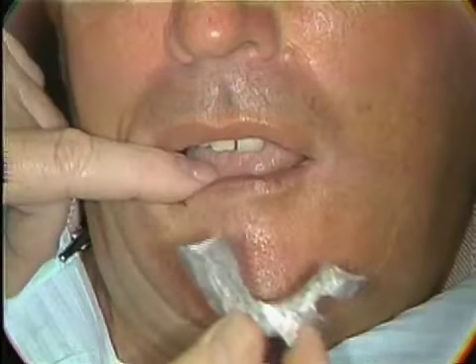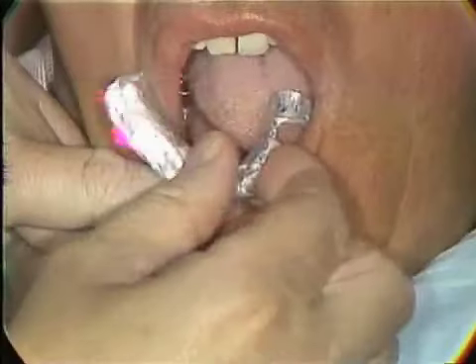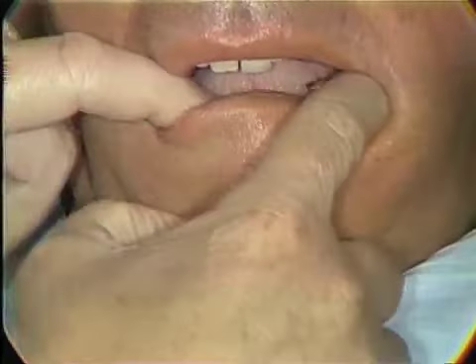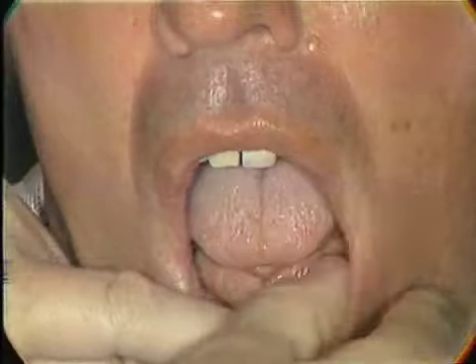The tray that we would use would be one that would not interfere with the peripheral tissues at rest, so that we can take the tray, place it in the mouth, and the peripheral tissues can assume the rest position. The patient can bring the teeth together and the lips together, and we can take the impression with the tissues at rest. Open, please.